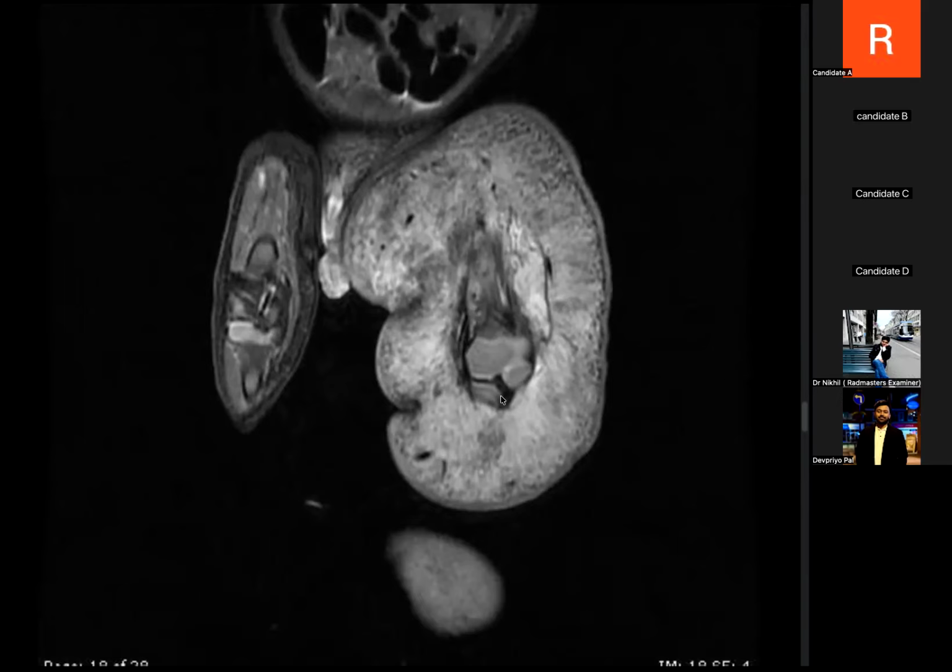I'm not really concerned about the diagnosis in this case, but the fact that you had a logical analysis to your diagnosis, and you gave a very sensible diagnosis, is commendable, right? So when you see such cases, mention that you would go for ultrasound first, you would look at the vascularity, and the same goes for the torsion case. You would go for an ultrasound and look at the vascularity, right? And then you would inform the physician and go on with that. So please think about malignancy also when you see a lesion like this.